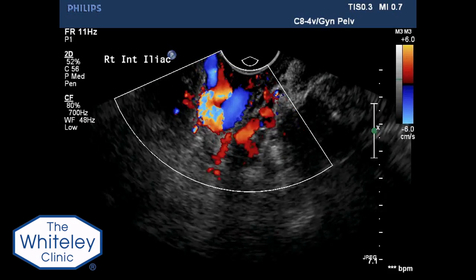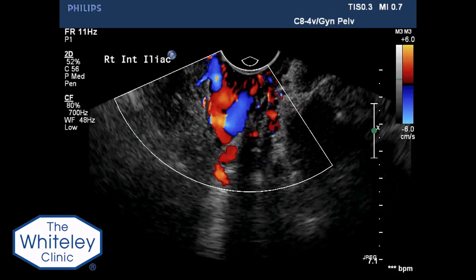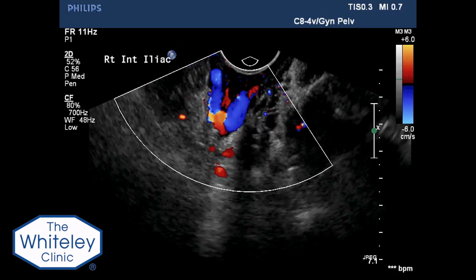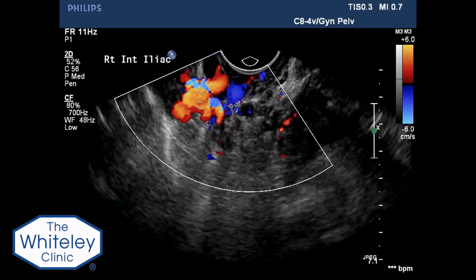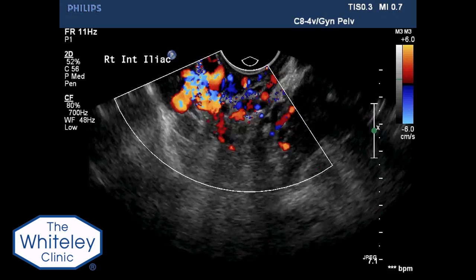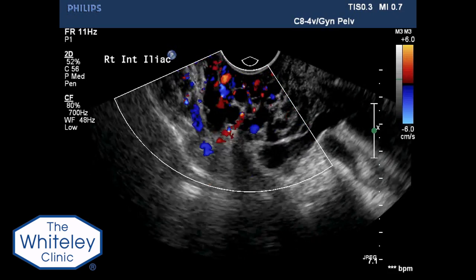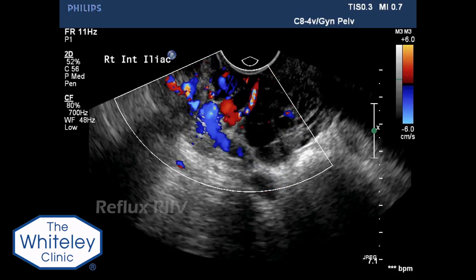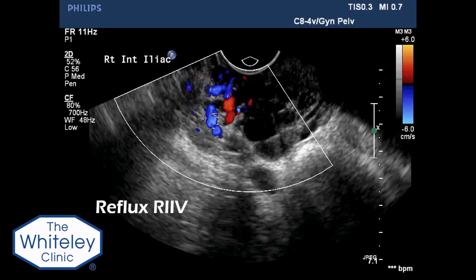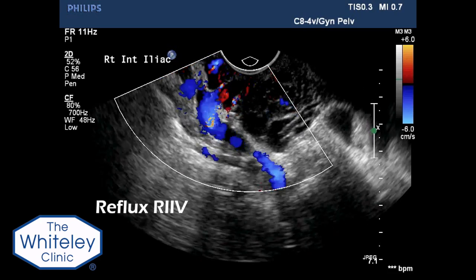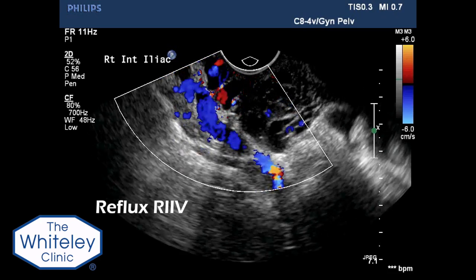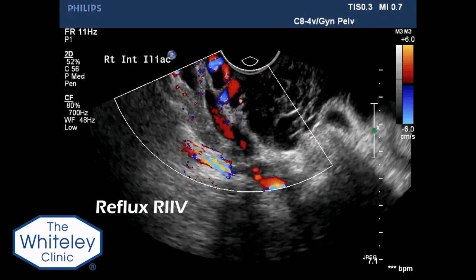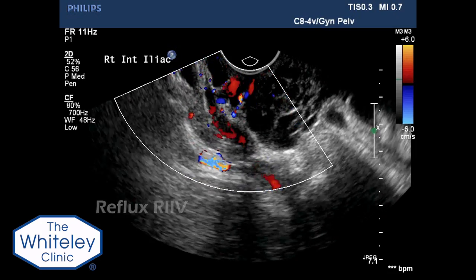On colour flow and Valsalva, gross reflux is seen in the right internal iliac vein and associated varices. As the internal iliac vein is viewed deeper into the pelvis, moderate reflux can be seen in the internal iliac vein.